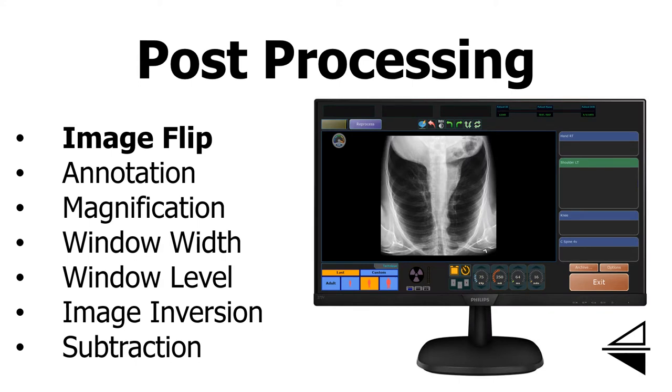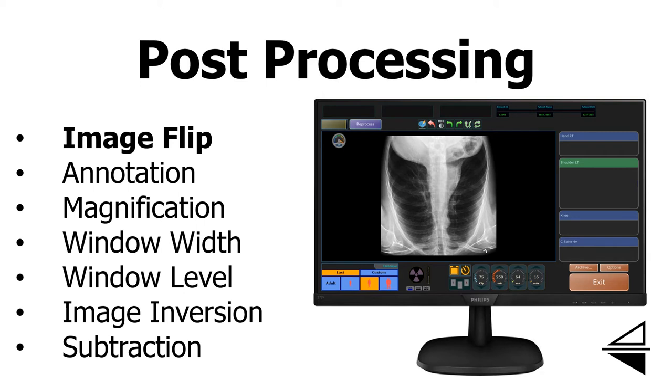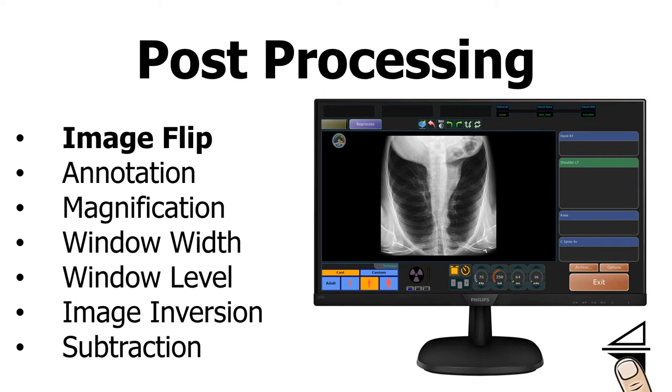There are many factors that could cause the orientation of your x-ray to not appear correctly when you take the image. For example, on this x-ray, I accidentally loaded my DR cassette upside down. In order to fix it, I'll need to flip this image horizontally.